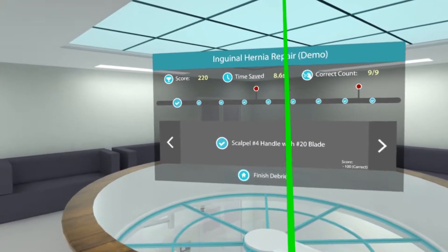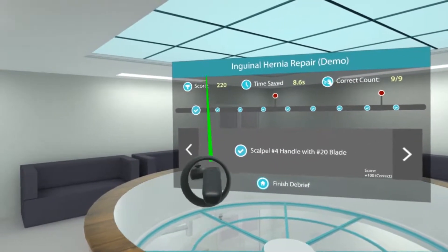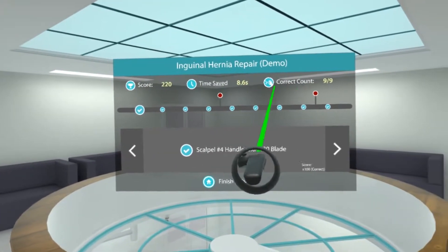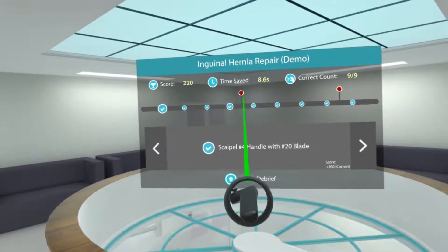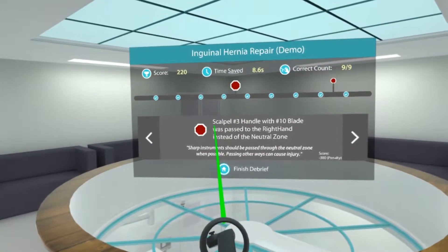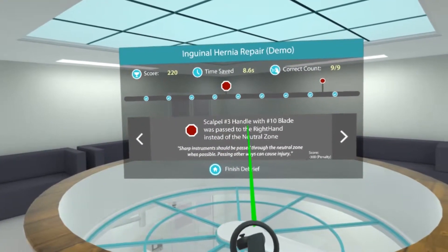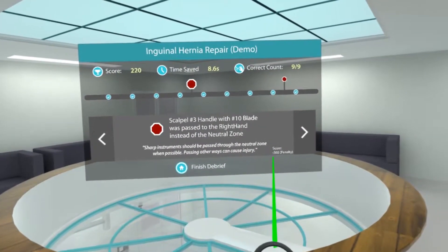Now what you can see here is the debrief screen. With this debrief screen I've got the score, time saved, and the correct count. You can see a track here, and if I highlight one of the areas where there was an issue — you can see here that the scalpel was passed to the right hand instead of the neutral zone, so I got a significant penalty because of that.